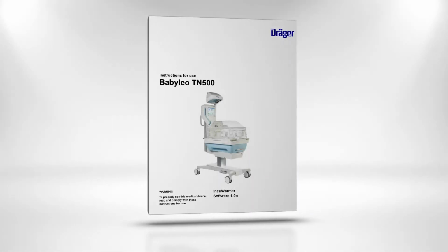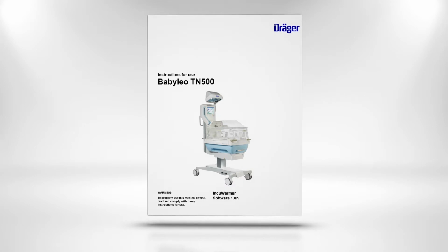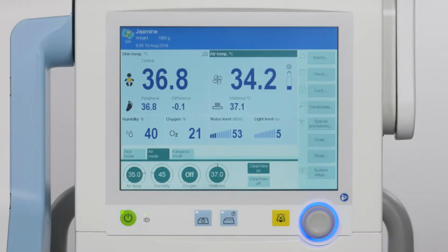Before beginning this section of our video, please check the instructions for use concerning all pertinent information on alarm limits. Alarm limits can be set for many parameters, for example, skin temperatures in skin mode, Kangaroo mode, as well as for air temperature and oxygen. There are two ways of setting the alarm limits.